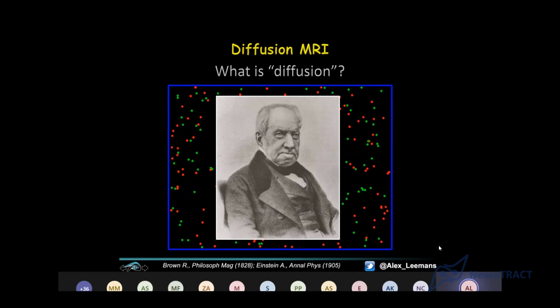Okay, and so this spread of molecules at the microscopic level mounts up to diffusion, which is a macroscopic effect in a way. So we will be looking at a kind of flux of one substance to the other.